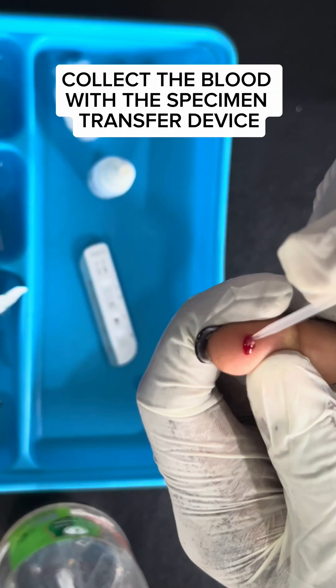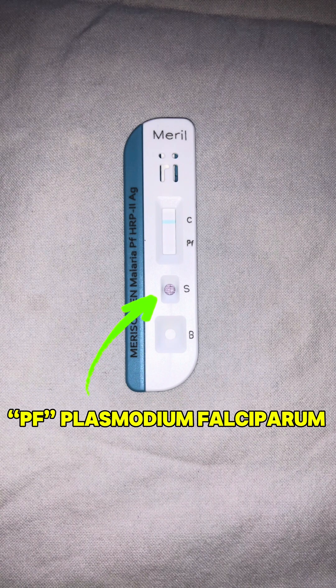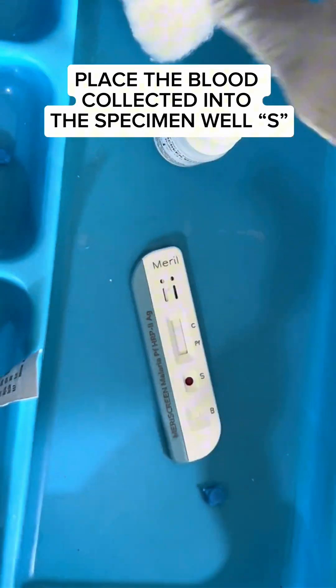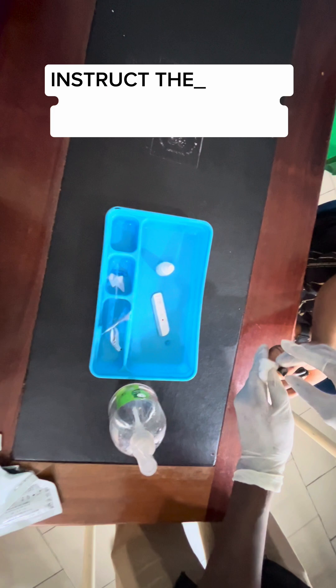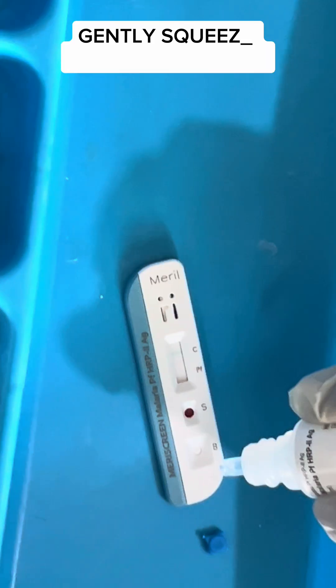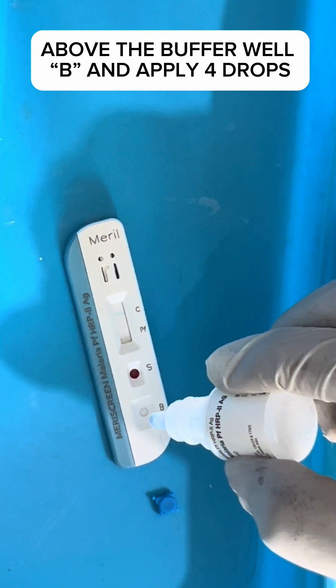Collect the blood with a specimen transfer device. Well B is for the buffer solution, and well S is for the blood sample. The test detects Plasmodium falciparum and includes a control line. Place the blood collected into the specimen well labeled S. Use the cotton to apply pressure on the pricked site.